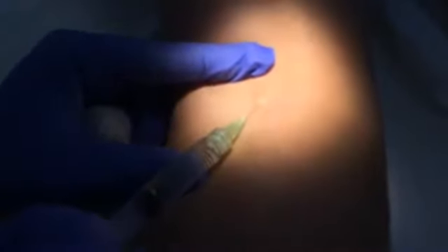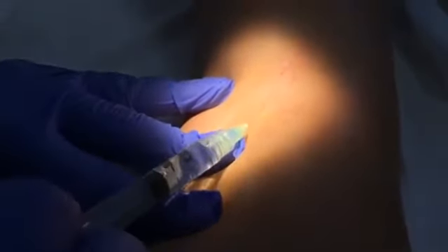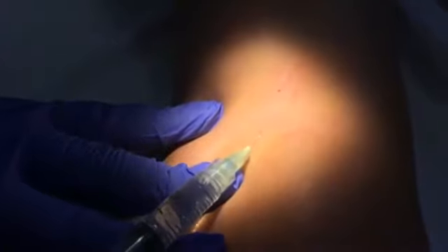And what that will do is spread then to the local veins and kill those. Same thing here. So if you can get the deeper veins, then it will kill the more superficial veins. As you can see here, we're in the reticular vein here as well. And that's just spreading now. You can see how it's spreading throughout all of those veins.